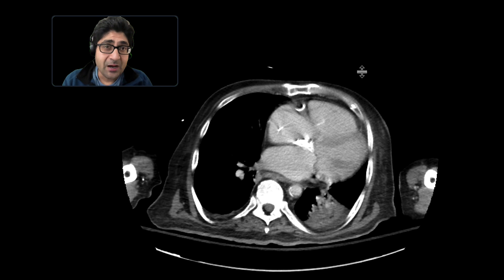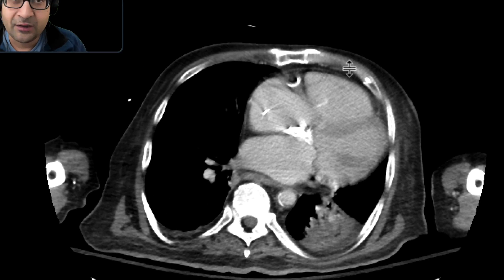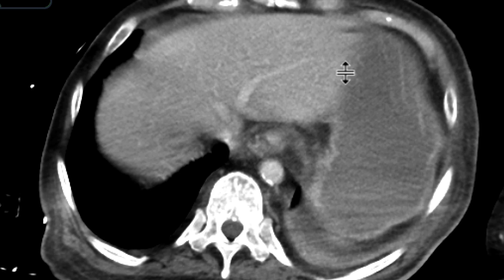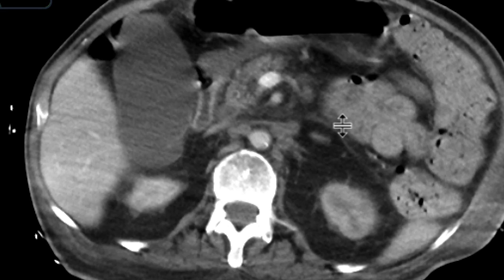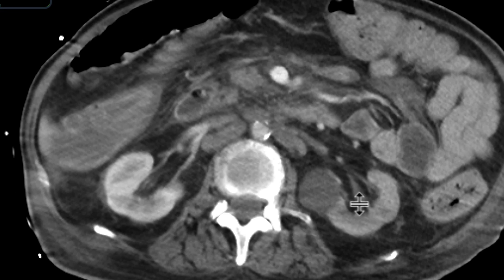This is a patient who came with abdominal pain and got a CAT scan with intravenous contrast to evaluate the etiology. As we scroll down on these images, we can see that there's a whole bunch of things going on, including a very distended gallbladder.